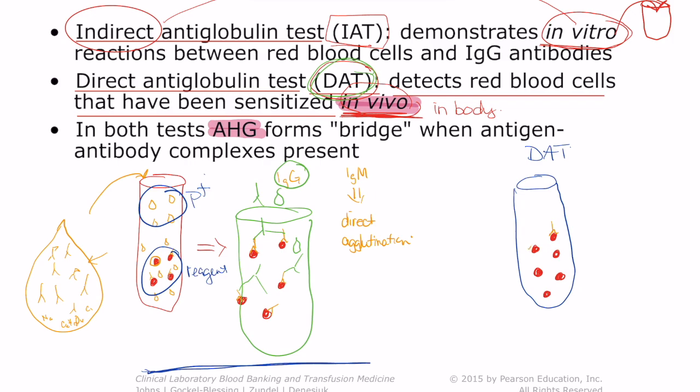Because remember, we're determining if the antibody has attached to those red blood cells in vivo. So we're not adding an additional antibody step here. We're just washing the cells.